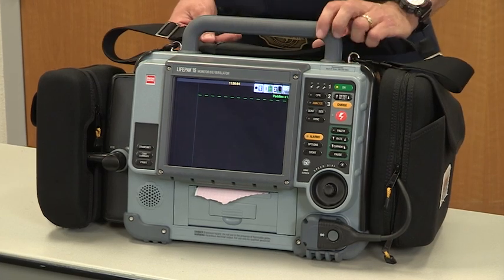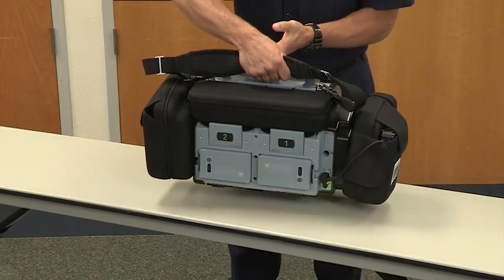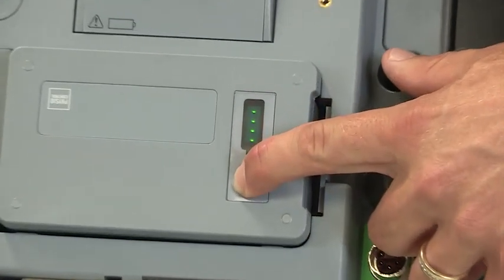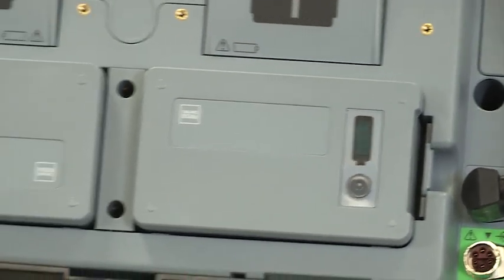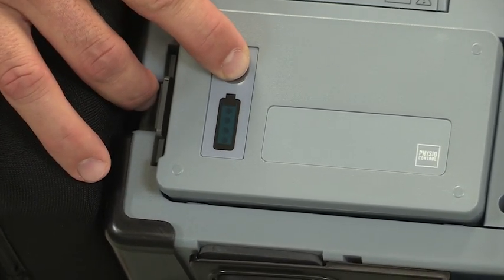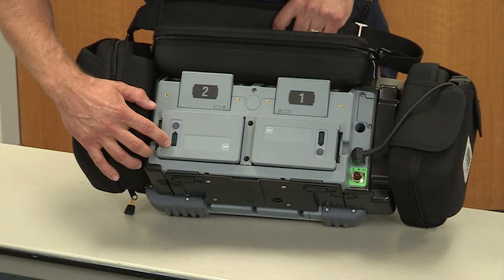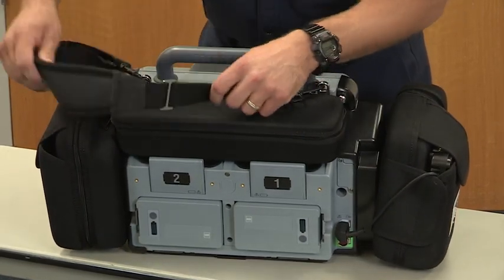Another way we want to check the battery status is by turning the machine around and checking the individual batteries in the battery well. You can simply do that by depressing the button and checking the battery status. Here you can see battery 1 is full. Check battery 2, and it confirms that we're below 25% battery life, which would indicate that we need to change the battery in battery well 2. If the batteries are anything less than full, we want to swap the batteries out in the morning for the battery that's in your desktop charger back at your station.